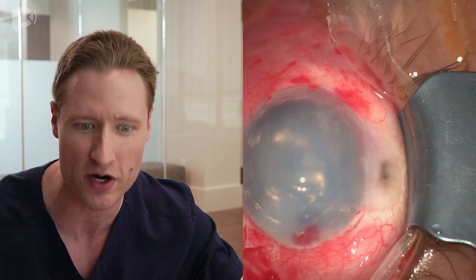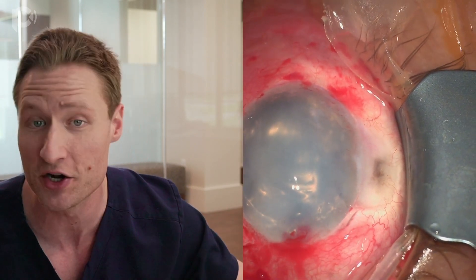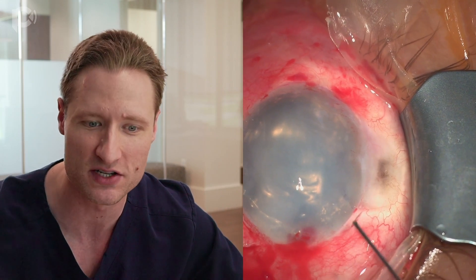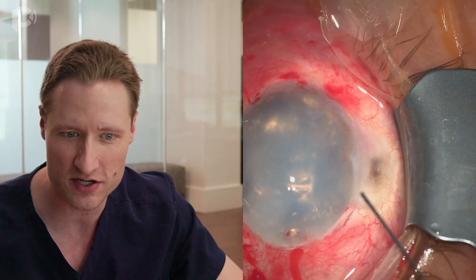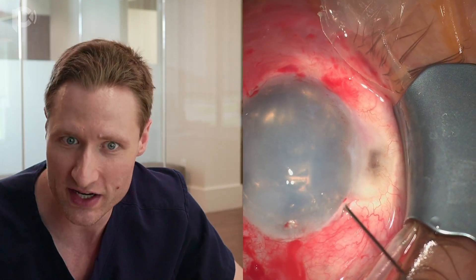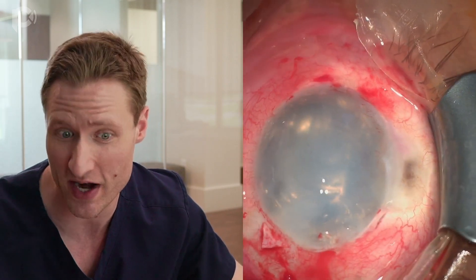The graft is now totally unfolded and up against the back surface of the cornea. I'm pressurizing the eye — we have basically a 100% air fill. The graft is entirely appositioned on the back surface of the cornea. You'll also notice that at no point did I repair the scleral flap or the sclerostomy that I created to do the vitrectomy.